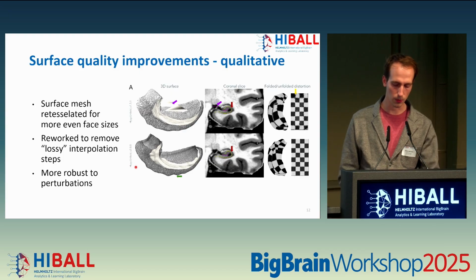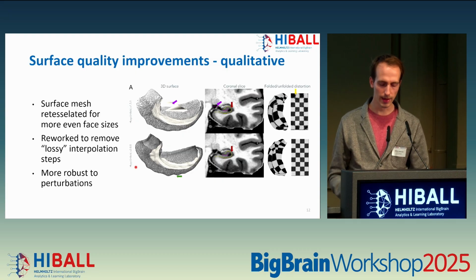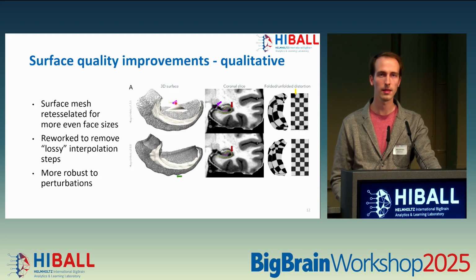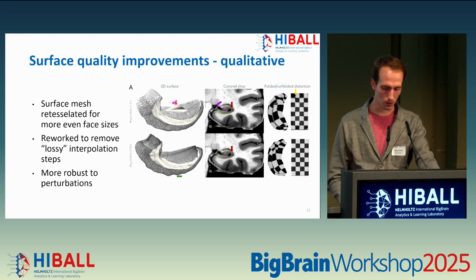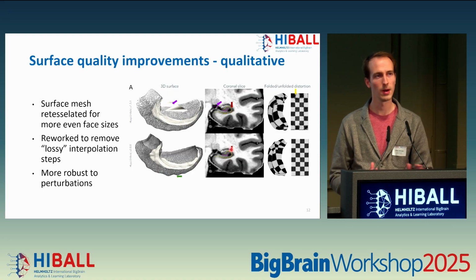We solved some problems. Some of the steps involve things like interpolation, which always degrades the data a little bit, so that could sometimes lead to these funny outliers. This is just 5 vertices along the dentate gyrus surface that create this huge ugly artifact. Instead of just removing those outliers, we've solved the problem at its core now, and we have no outliers being produced like that. Removing those lossy steps also allows us to fit almost perfectly the center of this tissue in version 2, instead of in older versions where sometimes it could become a bit shifted.